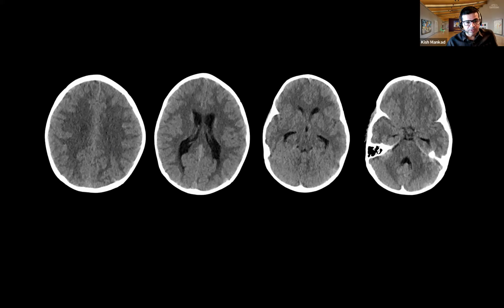Yes, you have only done a thick slice CT scan, so you get only the axial view, because it's not possible to reconstruct all of these scans into different planes unless you do a spiral CT with a 1 millimeter slice thickness.